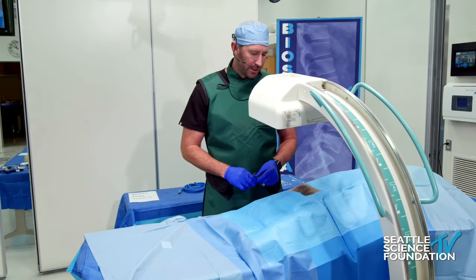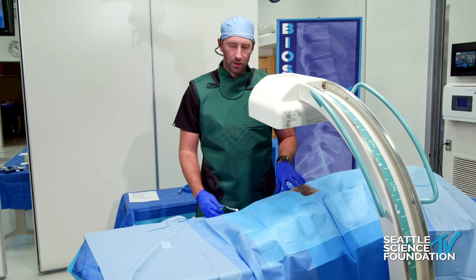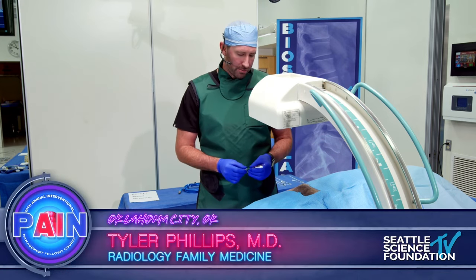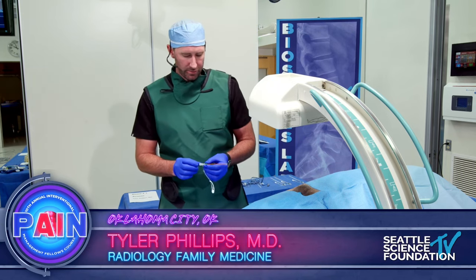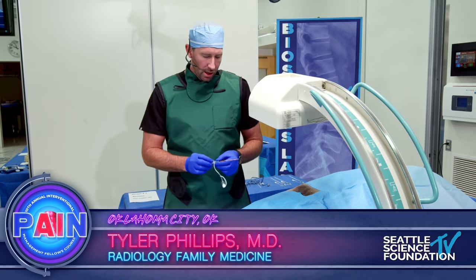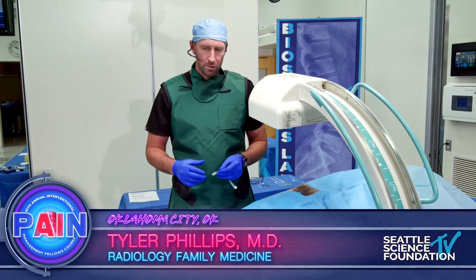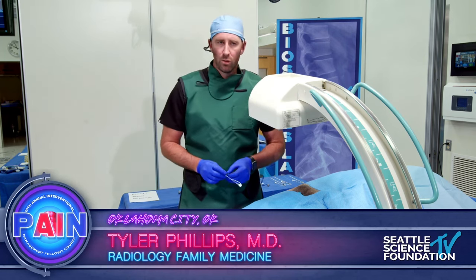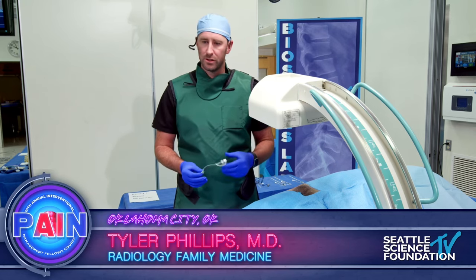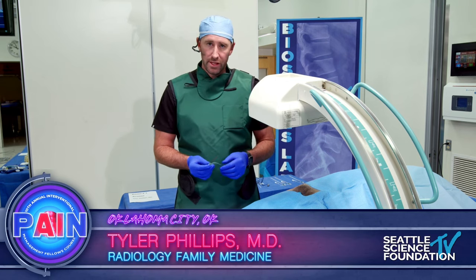Today we're going to be talking about radiofrequency ablation of the hip — a quick overview. We're going to show the procedures and the target areas that we'll be ablating. First, I want to talk about the specific large volume ablation needles we're going to be using. Unlike conventional or standard ablation needles that give us about 170 cubic millimeters, we're doing large volume anywhere from 470 up to 600 cubic millimeters of ablation size.